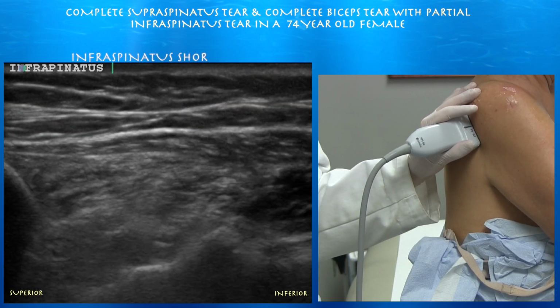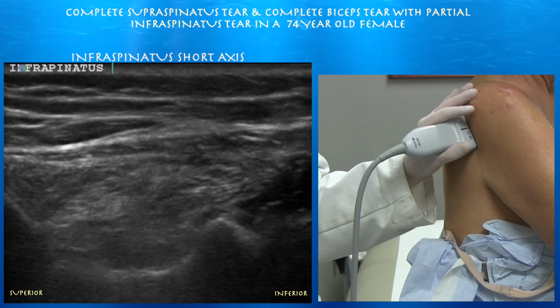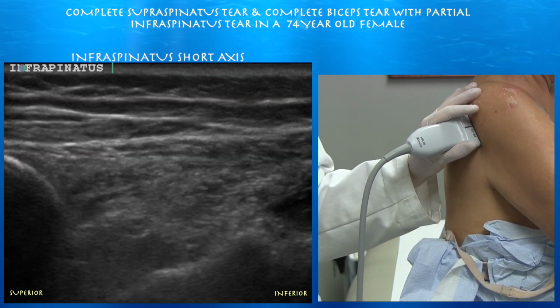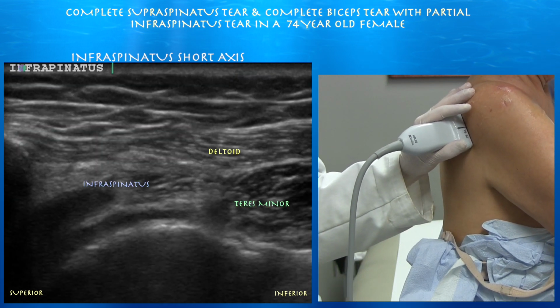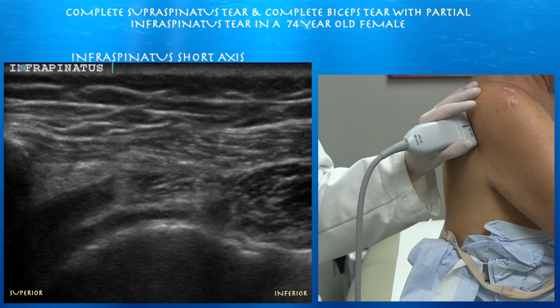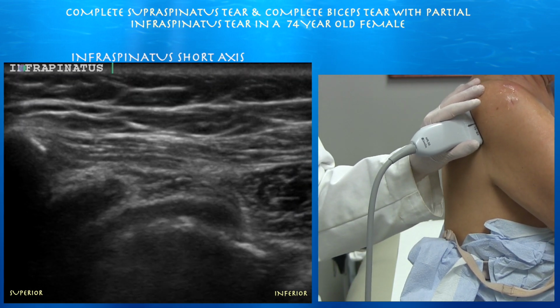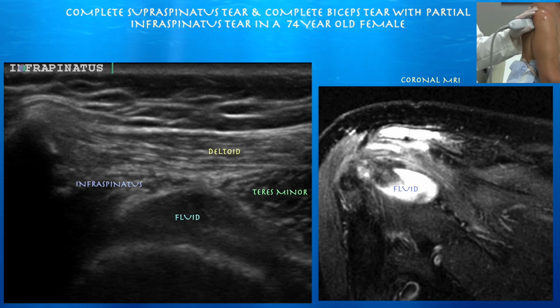Here we are. So looking at the two muscles, this is teres minor on the right side, and we got infraspinatus on the left. And you can see how the teres minor is dark, basically normal-looking muscle. Then you get all this kind of hyperechoic, atrophic infraspinatus muscle. And then I'm going to go closer towards the cuff now. The teres minor looks healthier and bigger than the infraspinatus. And you can see some fluid posteriorly.